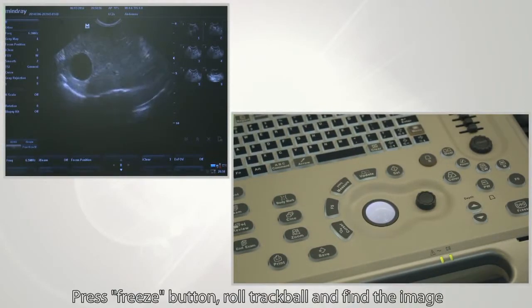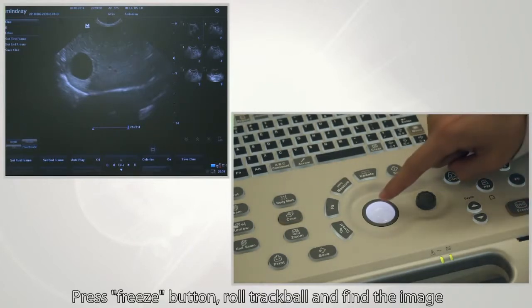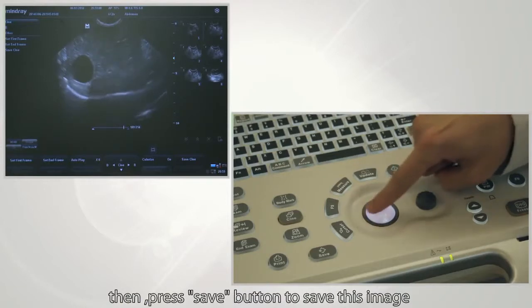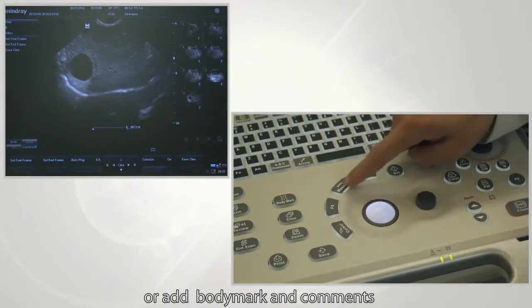One such parameter is the freeze feature. Press the freeze button, roll the trackball to find the image most suitable for your diagnostics, then press the save button to save the image. In this saved image, you can also make measurements or add body marks and comments.